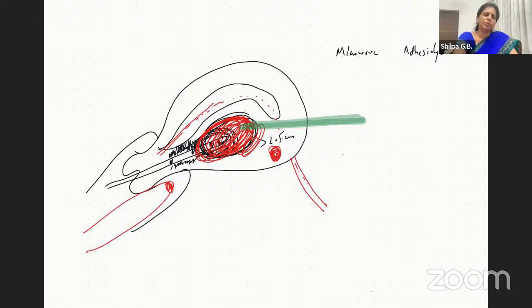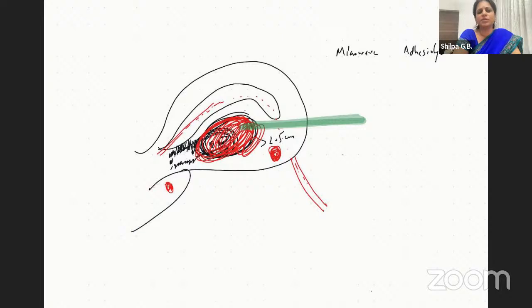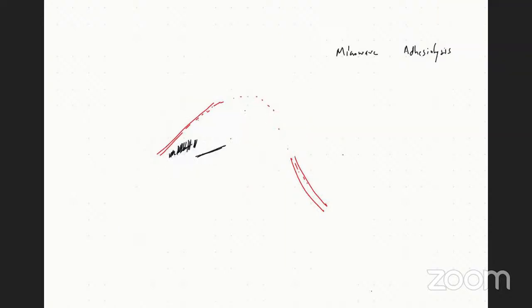Do you think it is operator dependent or can anybody just do it? Majority of our endoscopic surgeons are able to do a decent adhesiolysis, so all it takes is getting that machine, buying the probes and starting to do it. Yes, madam. Basically it depends on how good your adhesiolysis is. If you have knocked out everything, ureter till the tunnel, bowel till below, fallopian tubes, ovarian fossa, everything, then the outcome will be good, madam. That means you will be able to give the patient a good outcome.